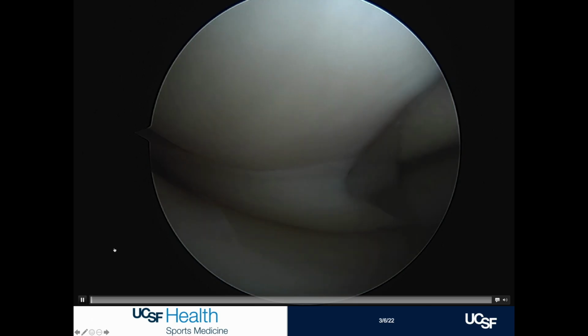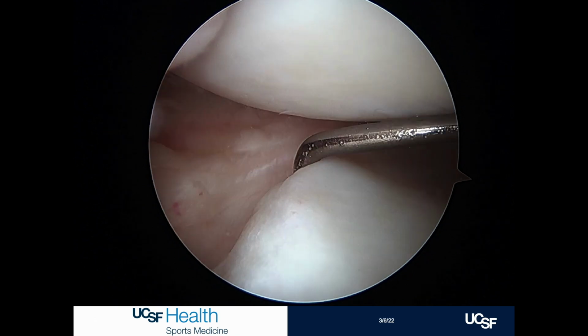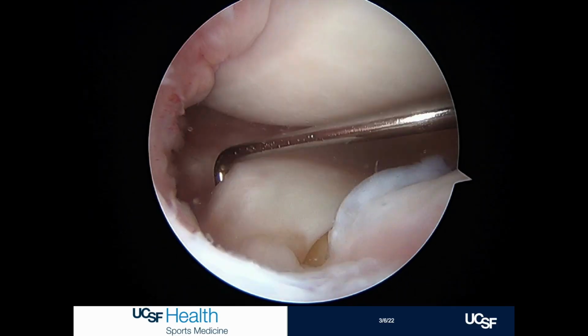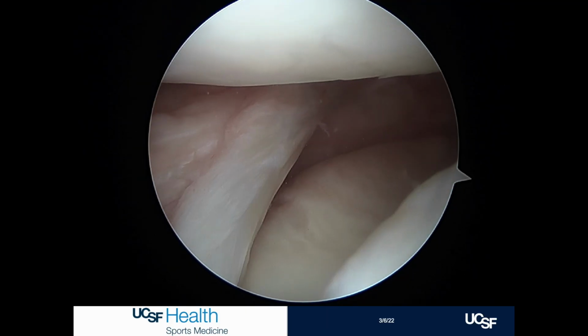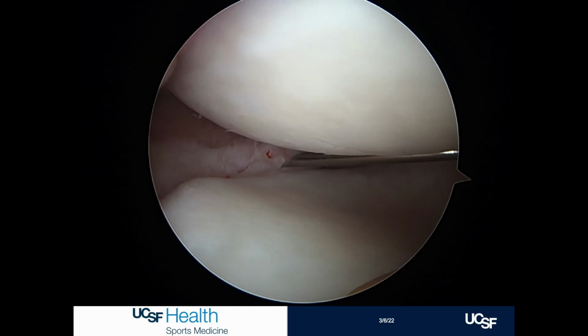At the time of surgery, we were able to see this actually unstable medial meniscus, so this was clearly at a minimum a bucket handle type tear rather than just a simple vertical. And then putting the scope in through the notch, you can pull the meniscus aside and see there that there's a very large ramp lesion, in fact one of the largest ones I've seen, that extended medially but clearly was unstable.